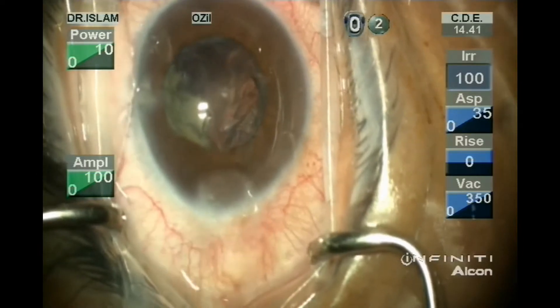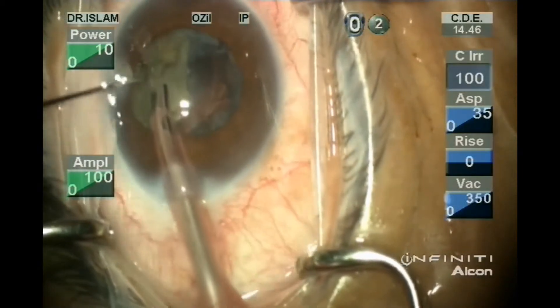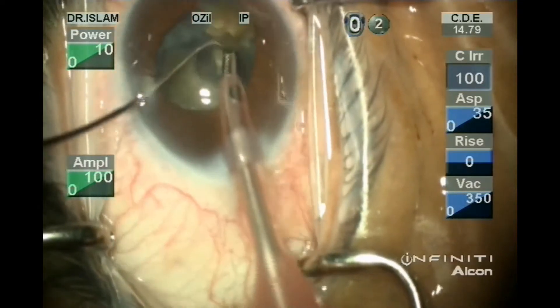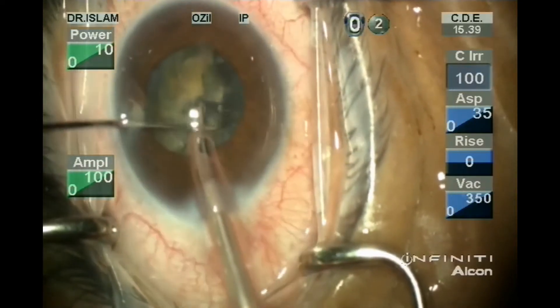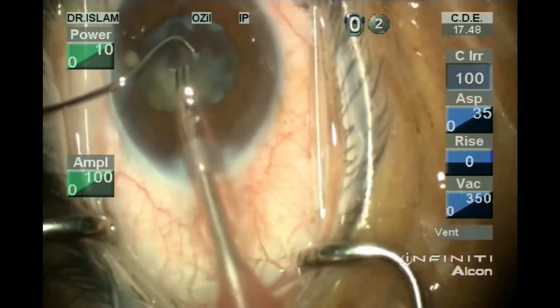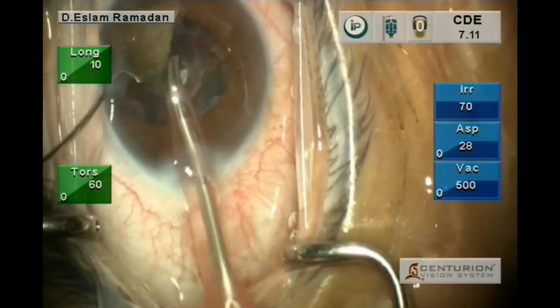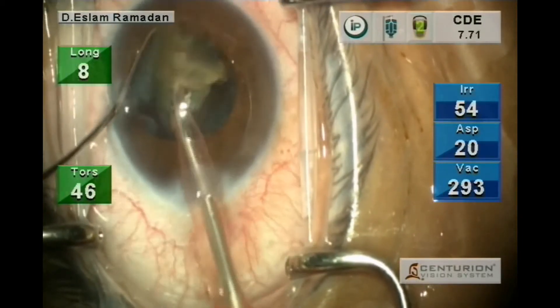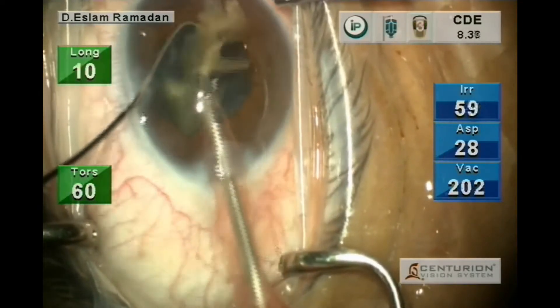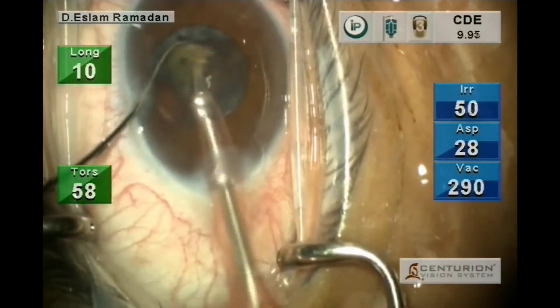Filling the bag with viscoelastic. We are using methylcellulose for the whole procedure and only Healon for the implantation. Now completing the last piece with the Centurion. As you can see the anterior chamber is stable. Capsular bag is stable.